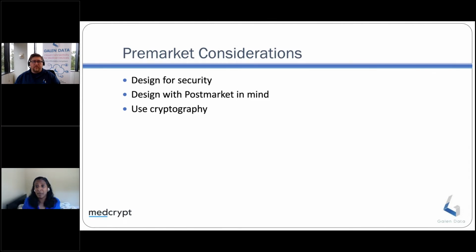As we talked about, patient safety is at the core of what device makers are meant to do. They're here to deliver some sort of clinical intervention. And if we make it harder to do that, that's not really solving it from a security perspective or from a use perspective. So we really have to think about how security can work with the use case of a device, and how that can be enabled and sustained so that folks don't just bypass it and stick a post-it on the pump and work their way around that.